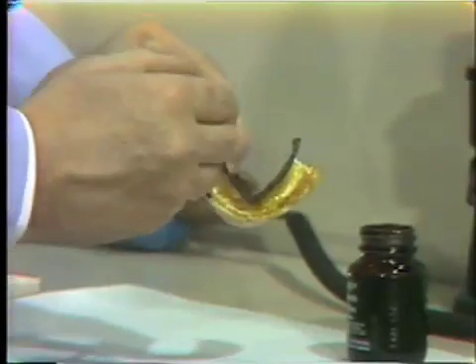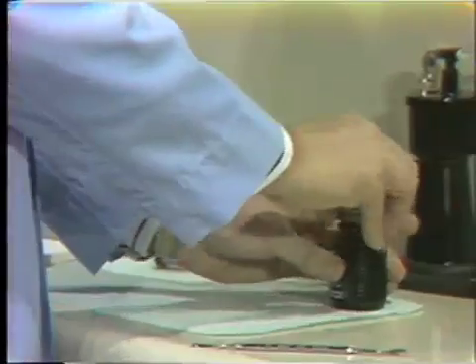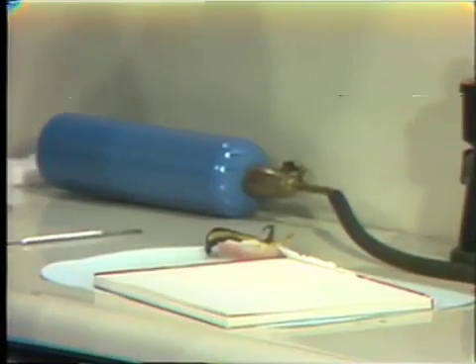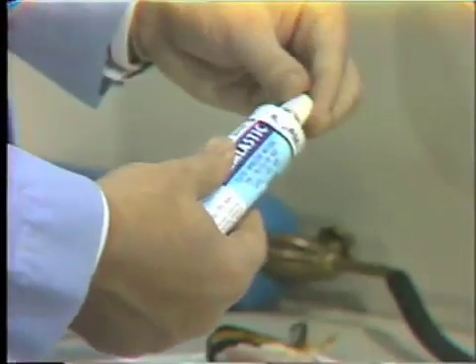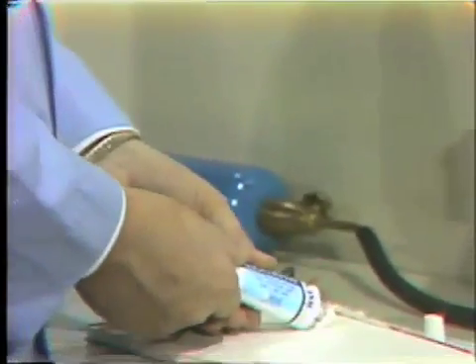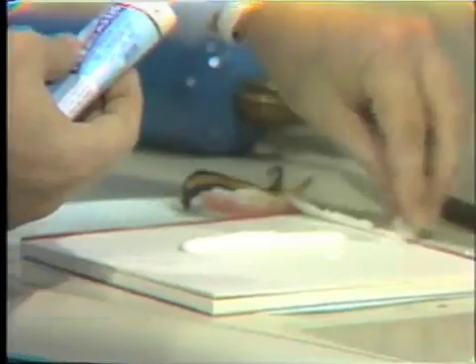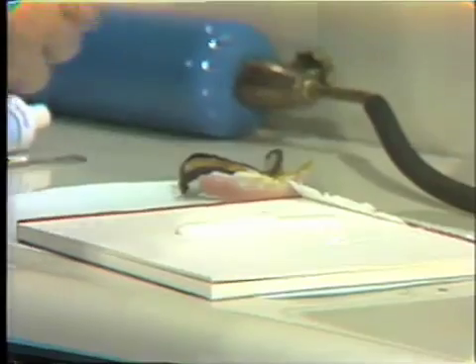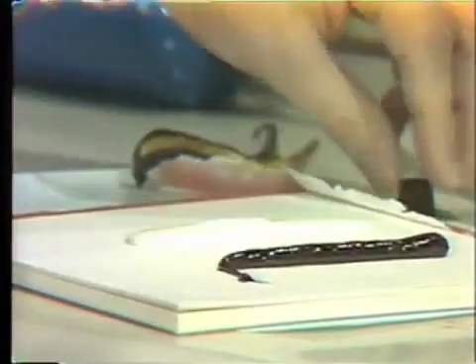Having completed this, we set the tray aside and let the adhesive dry, and while waiting we can begin to dispense our impression material. We will be using the light-bodied rubber base — equal parts of the base and the catalyst, approximately two and a half to three inches of material will suffice. Remember, this is a wash, not a full impression. Be very careful not to permit the catalyst and the base material to run together at this time; they should be widely separated on your mixing pad.